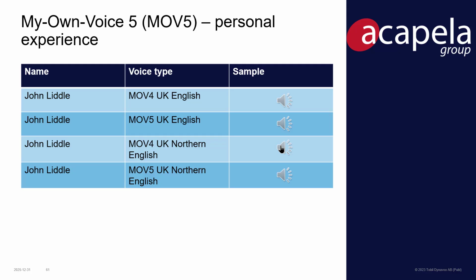Now, I'm really happy there with the vowel sounds, but not so happy with the crackly nature of my voice. So let's have a listen to the My Own Voice 5 UK Northern English.